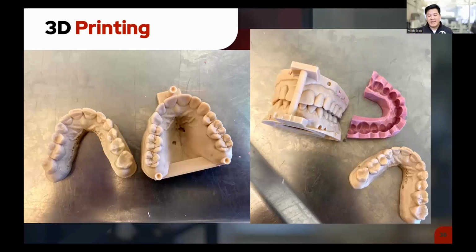My personal hands-on time for the design: a smile design, if you're very proficient with it, is 10, 15 minutes. If you're doing a full mouth, upper and lower, and you're a beginner, I'd say set aside 4 hours just to get proficient. The nice thing is, when you design a full mouth, you only need to design half. You design from the first quad to the central incisor, and then the lower fourth quad, and then you're able to just mirror that on the other side. That saves you a lot of time if you figure out how to play with the design to get that done.